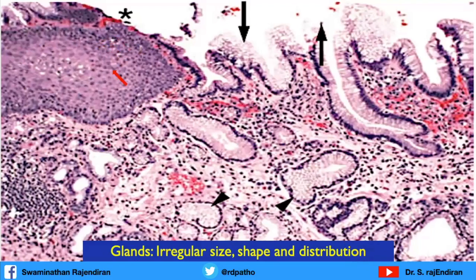So this is a squamous epithelium. This is a gastric cardiac type of epithelium. So this is a gastroesophageal junction. Here you can see nice bifid glands. And see the glands are not uniformly distributed. Variation in size. Some glands are small, some glands are large, and these glands are not branching normally, but you can see a nice bifid gland. So these are all features of chronicity. Irregular size, shape, distribution means chronicity.